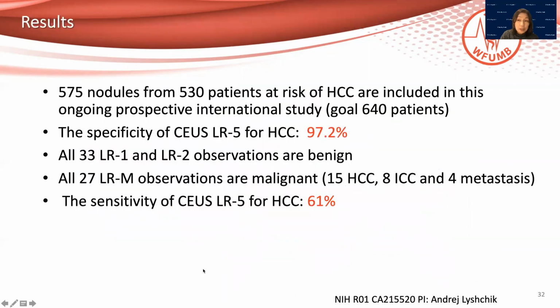This is the interim analysis that was presented at RSNA last year. With 575 nodules from 530 patients, the specificity of CEUS LI-RADS 5 for HCC was 97.2%. So that was very encouraging.